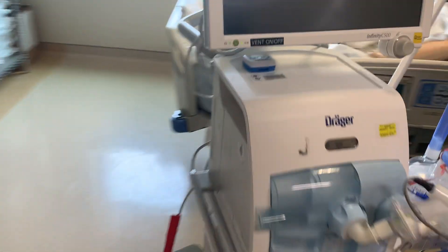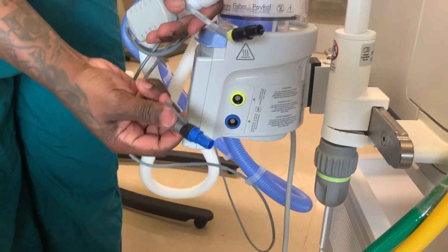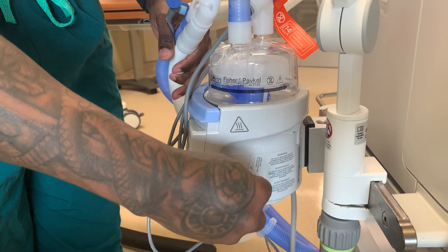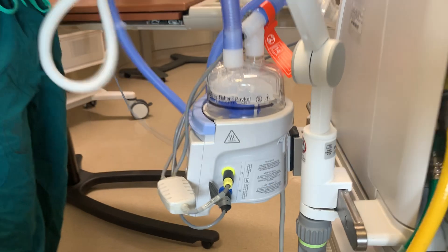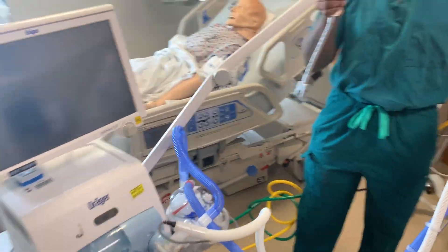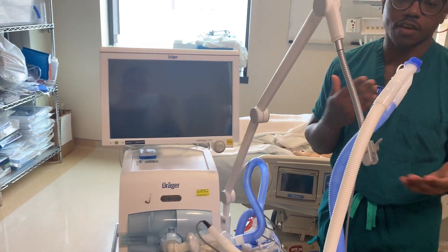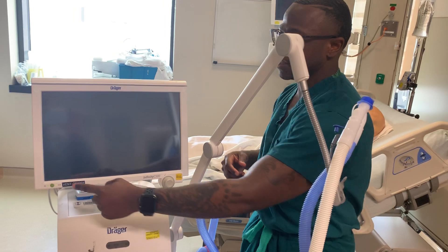On the back of the heated humidifier, blue connects to blue and yellow connects to yellow. Once you get those clicks, you're good to go. Now our circuit is all set up. I have my circuit arm there, and I'm just going to hang the circuit there. From there, I have everything connected for us to put it into patient use. I'm going to hit the power button right here.